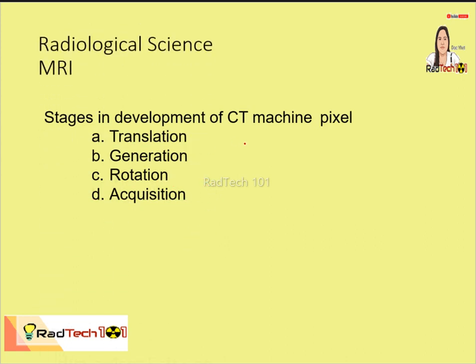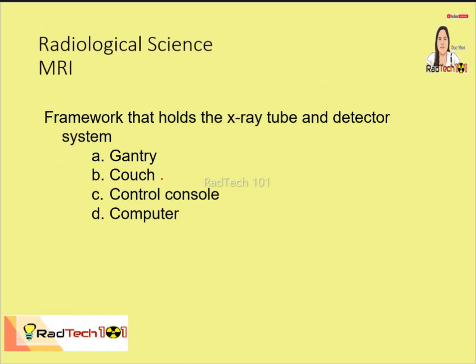The stages and development of CT machine. So, I think, lumabas ito sa board exam before. So, it is termed as generation. The framework that holds the X-ray tube and detector. So, ito yung major framework, yung poste ng ating X-ray tube and detector, that is the gantry.